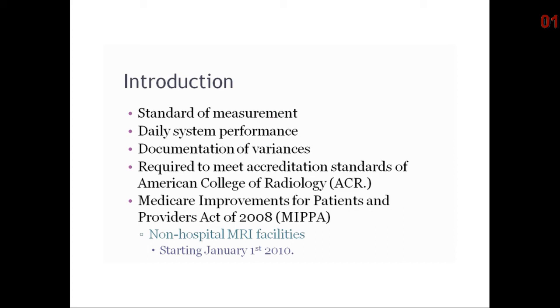The ACR has developed an MRI accreditation program to keep MR image quality uniform across the country. New and used scanners will vary in image quality, and the program is designed to review qualifications of radiologists, MR scientists, medical physicists, and technologists, and also clinical imaging quality and the effectiveness of QC testing procedures of each site applying for ACR accreditation.